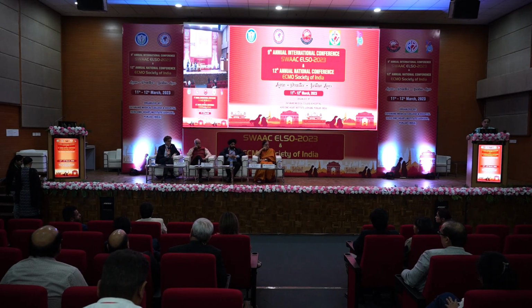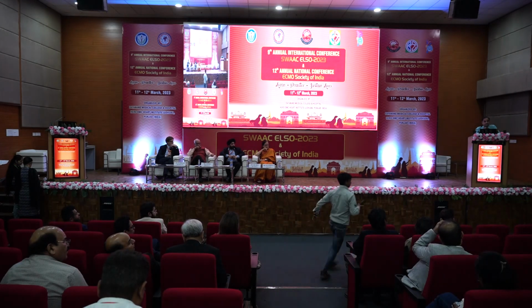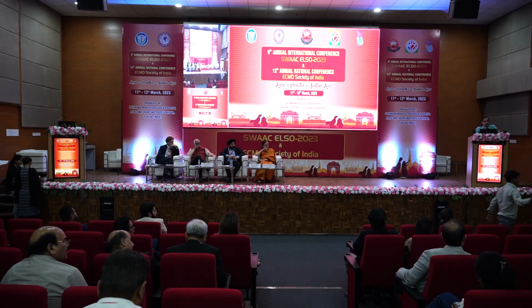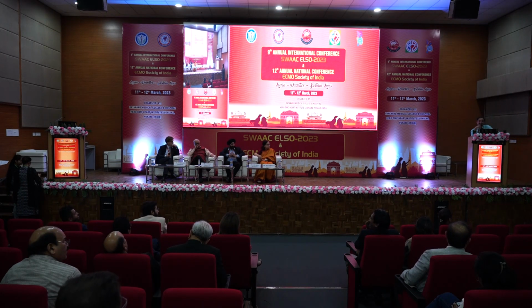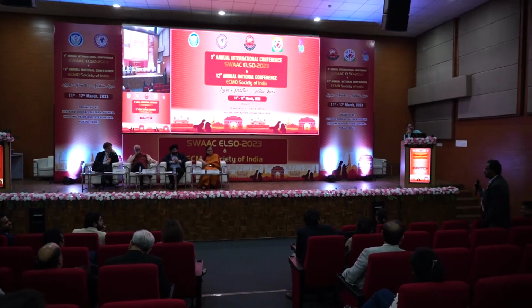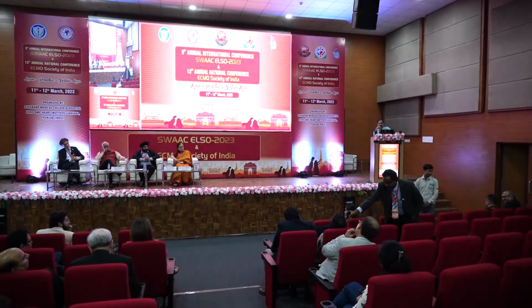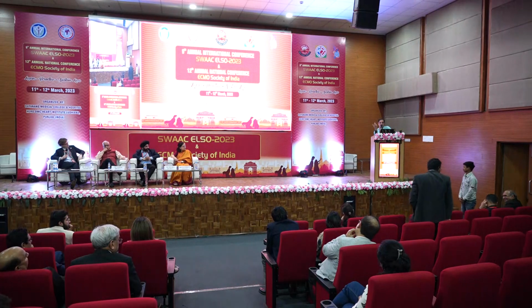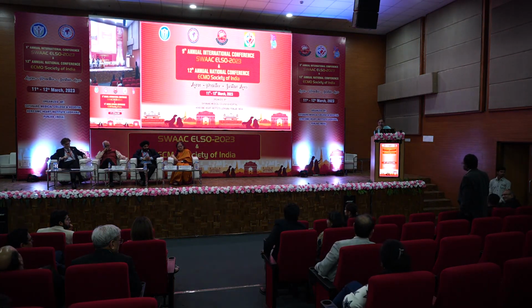Any other questions? Is there any data to say which one is better, awake ECMO or proned ECMO? I have not come across that. Not on ECMO at least. I think one of the problems is I'm not sure how awake we can keep the patient when on ECMO in the prone position. That may be a really tall ask, but I'll be happy to be corrected.